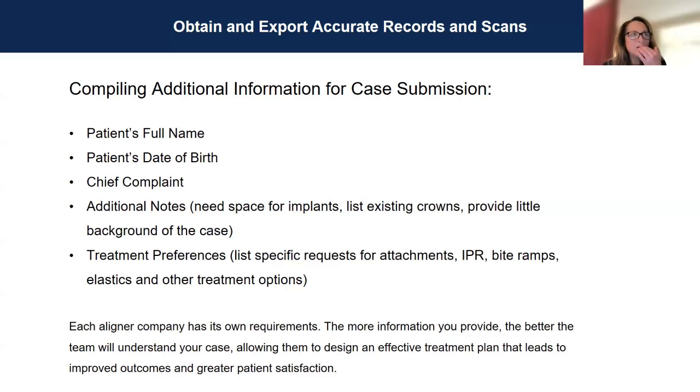I think I did answer a similar question, because the patient has a face, right? If they have a photo of the patient's face, and, I hate to say it, if their nose is off-centered, and they're trying to follow just the upper and lower arch and they set that midline, it may not look right on that patient.